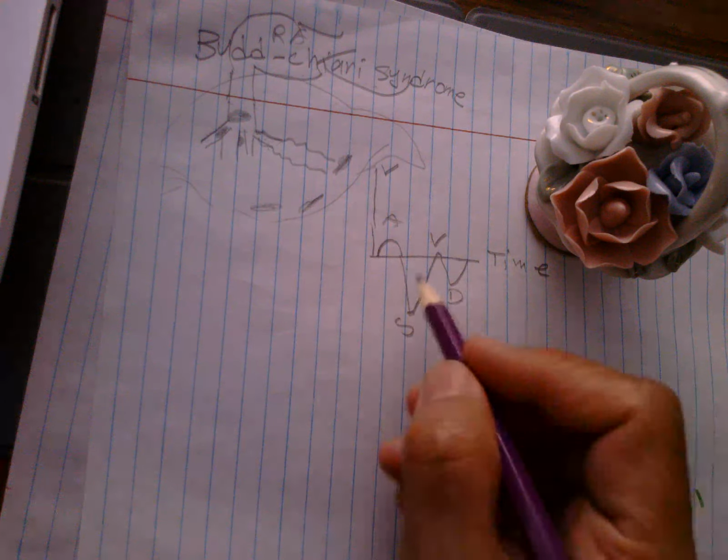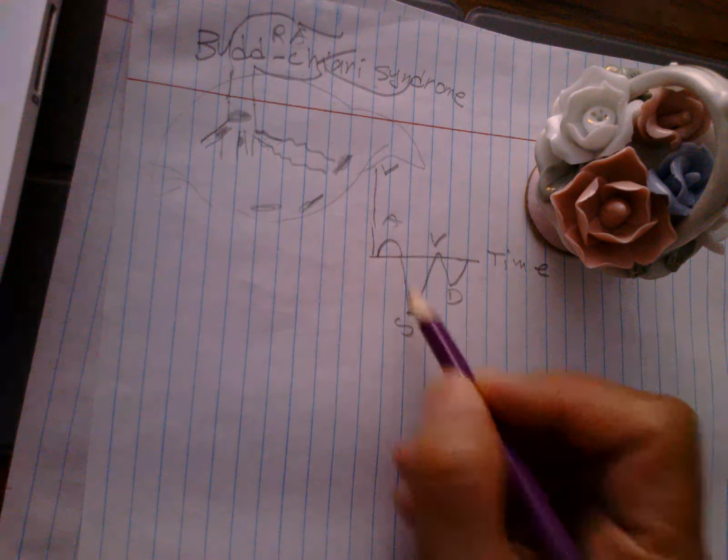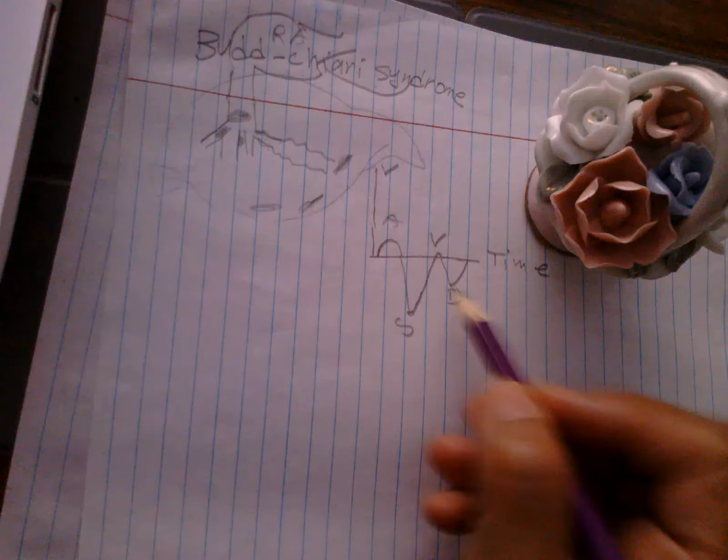So it is a normal dip and peak, dip and peak like a W.